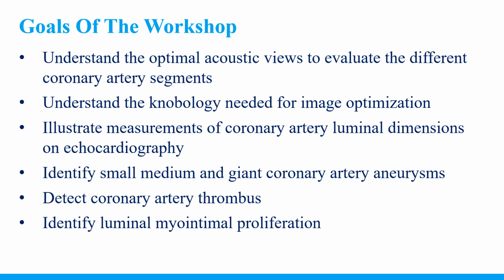As I said, the goals of the workshop are to understand the optimal acoustic views needed to evaluate the coronary segments. The faculty will go over knobology needed for image optimization, how we illustrate measurements of luminal dimensions on echo, how to look for small, medium, and giant aneurysms, how to detect thrombi, and identify luminal myointimal proliferation.